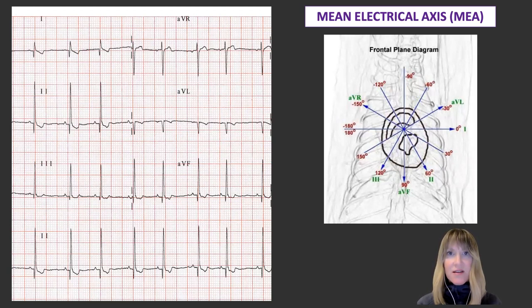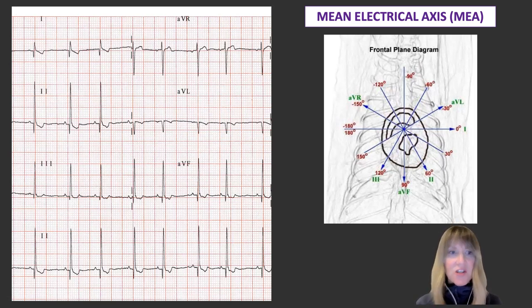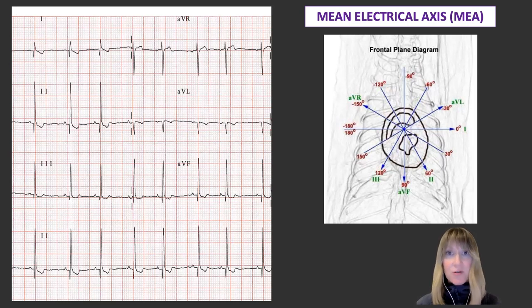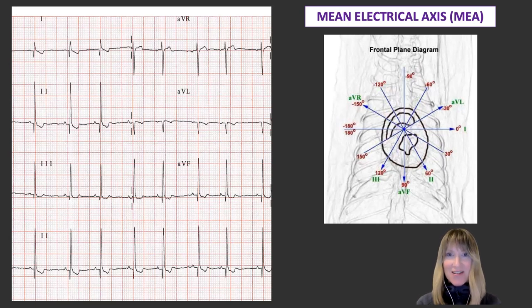We can see that the six leads displayed here in this dog's ECG — leads 1, 2, 3, AVR, AVL, and AVF — are oriented around the frontal plane in various directions, as this diagram shows. Each one of those leads represents a line of sight, kind of like a spectator in a stadium. The positive pole of each of those six leads, which is that spectator's perspective, is represented by the arrowheads on the frontal plane diagram.